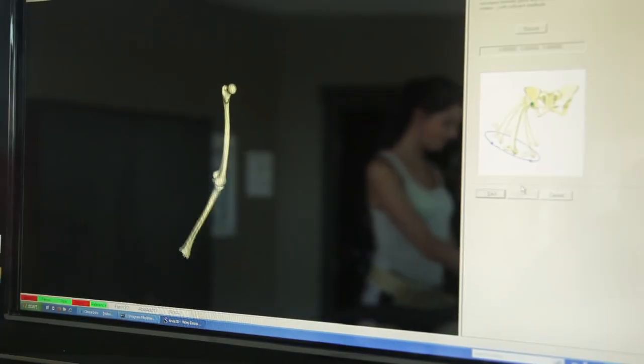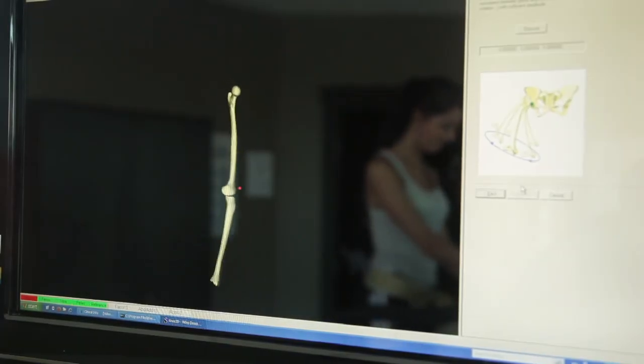You test them on the KneeKG machine first, you then do whatever treatment it is you plan to do, and then you test them again and see if that's by alleviating pain, changing alignment, building up strength, that their function is better and their mechanics are better. This could be revolutionary in allowing us to treat patients better, reduce costs, and make for a lot more happy patients who don't need an operation.